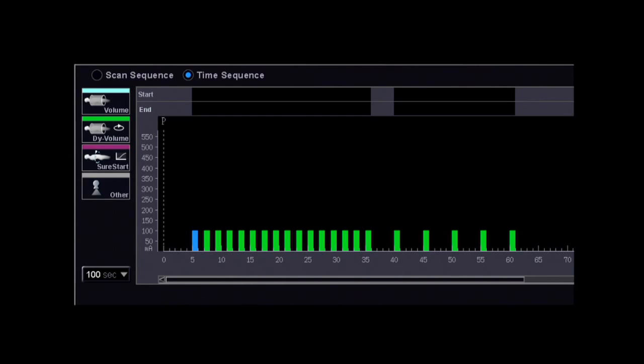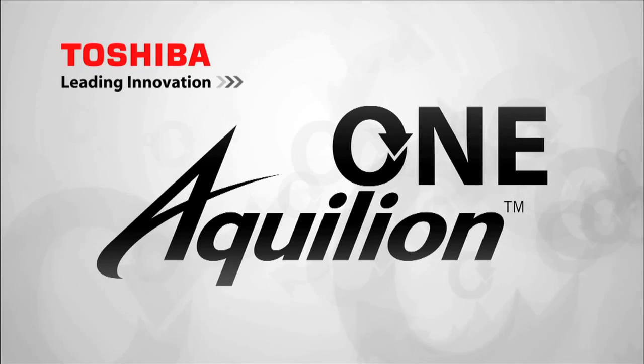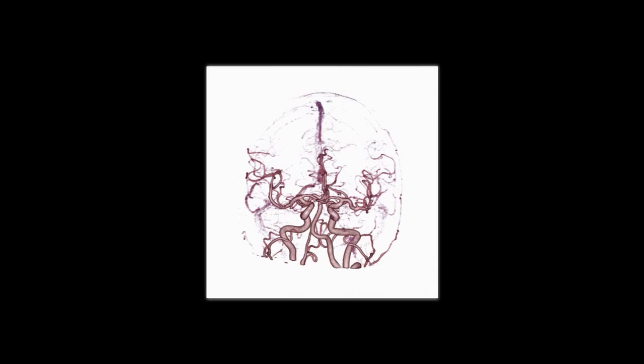And Aquilion 1 is the only CT system that allows this due to its 320-row detector covering up to 16 centimeters of anatomy. All 19 volumes have been acquired, and the data is automatically sent for processing and review. The first image you see is a pure arterial CTA with contrast and temporal uniformity. What you do not see is any bone. The bone has been automatically subtracted from all 19 volumes. And as you see, we have beautiful detail even through the internal carotid region.